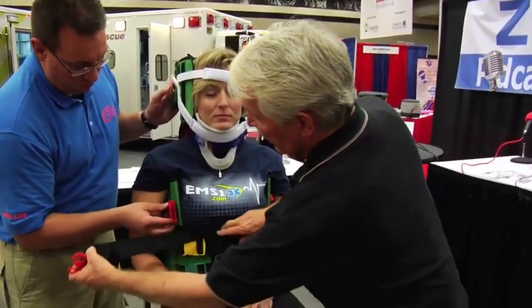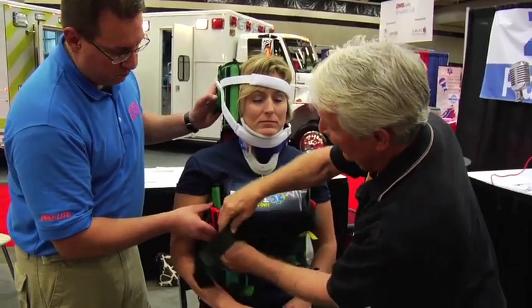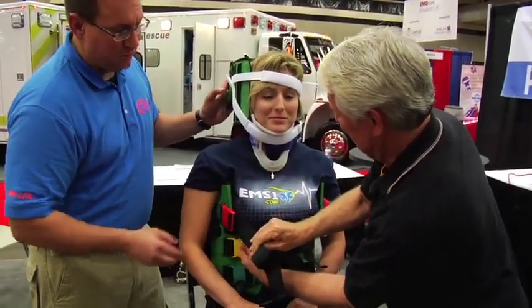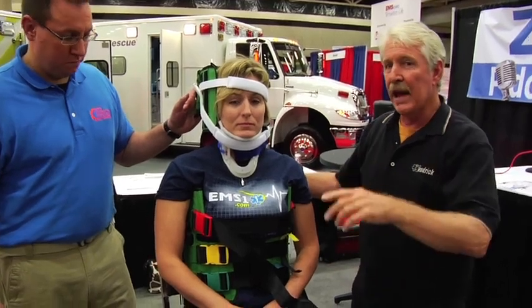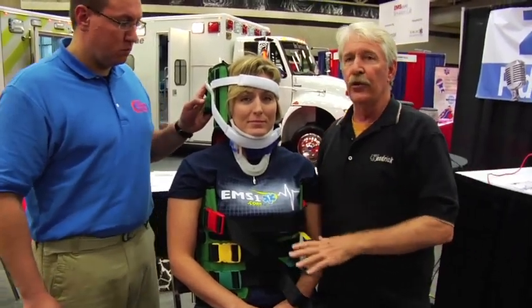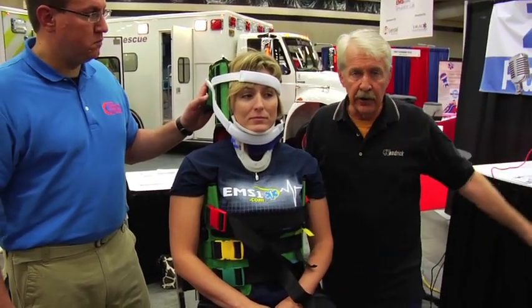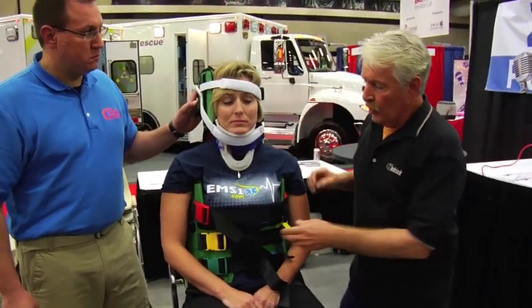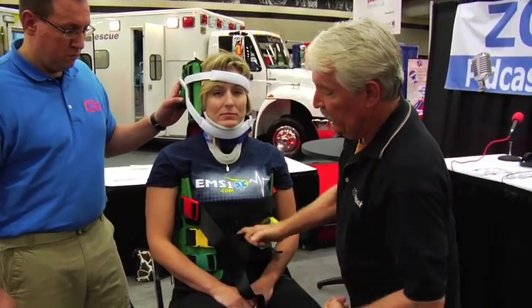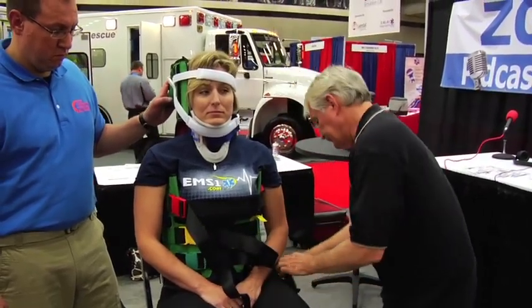What we're trying to do is give her a little extra stability without compromising. Now, we've used all of the straps. If we had more time, we'd backtrack a little bit and show you how you could do this for a rapid extrication type evolution. But we have the gurney and the long spine board waiting outside the vehicle — we're ready to move. Go back and recheck the straps, because as soon as you start putting extra straps on they loosen. Retighten and keep the leg straps.